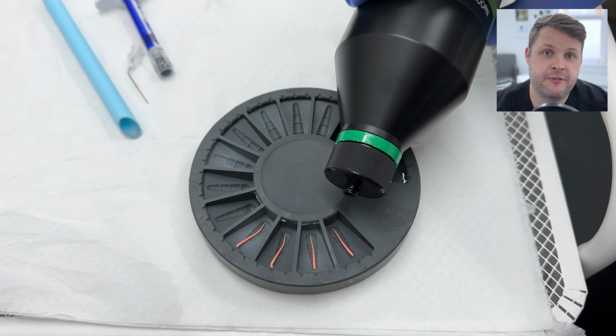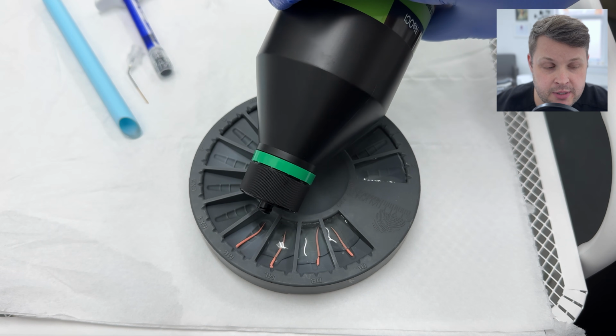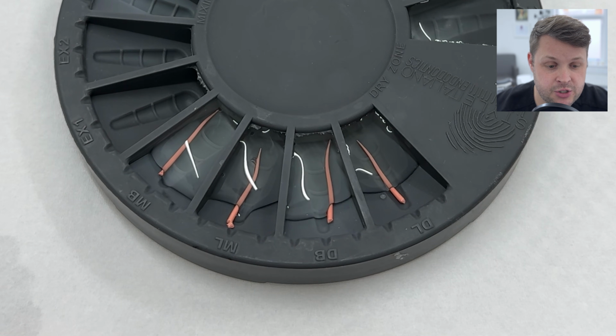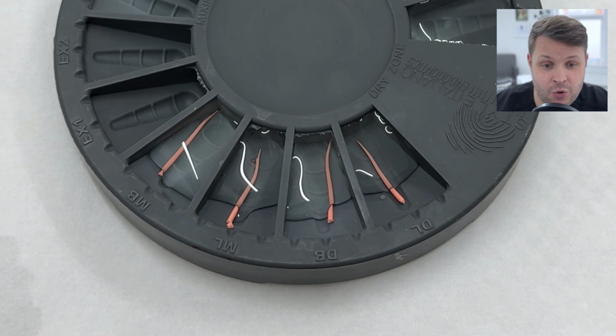And this serves a few purposes, okay? Obviously you want to disinfect the GP points with sodium hypochlorite, because most GP points are just in a little tiny box, so they're not disinfected. And obviously you've just disinfected the root canal space and got rid of all that bacteria, and you don't want to then place, theoretically, GP that has bacteria on it.